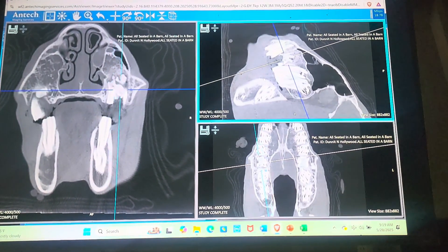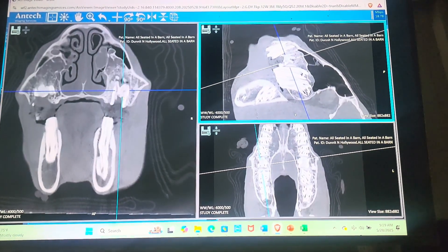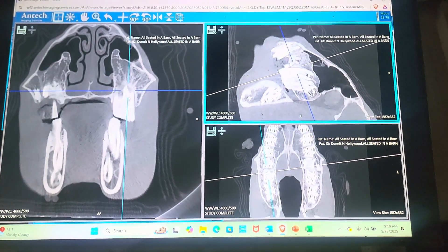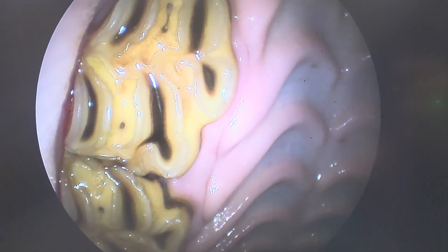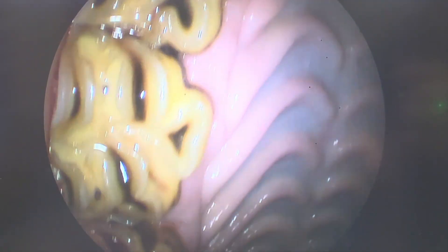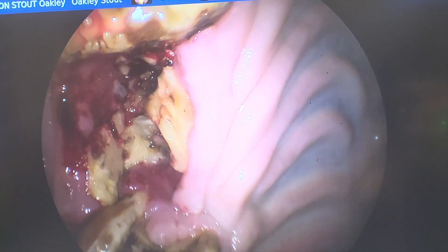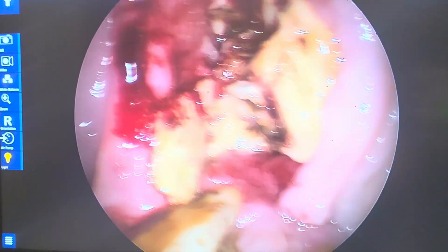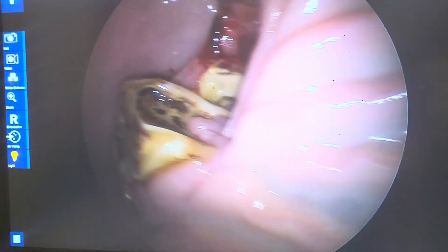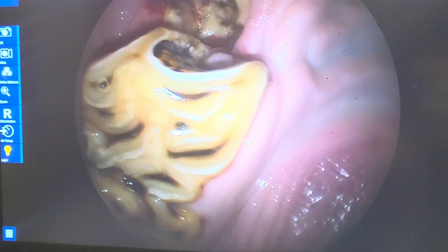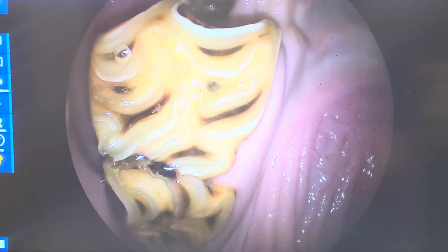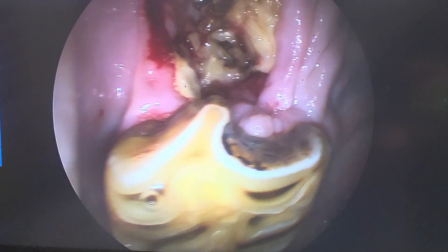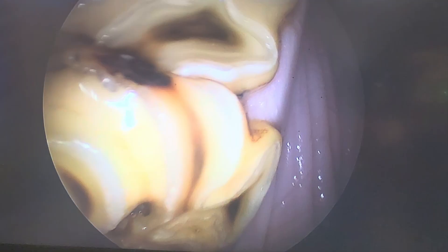The horse lives far away, so we're going to try our best to do both teeth as quickly as we can to give them the best chance at recovery. Next, we'll go look inside the mouth with the oral endoscope. Here we're looking at the 109 — there's a little bit of blood, we cleaned it out, there was a lot of food in there. This tooth is fractured with really nothing to get a hold of. The number 10 tooth here is the one that's rotated — this part should be on the buccal side. With these types of teeth you have to be aware and look for periodontal disease.